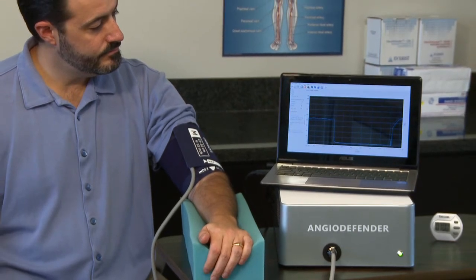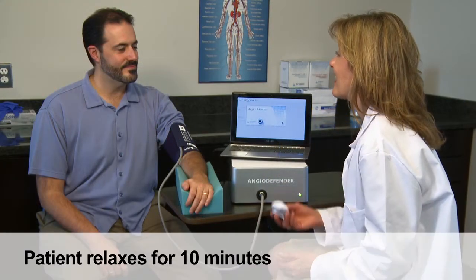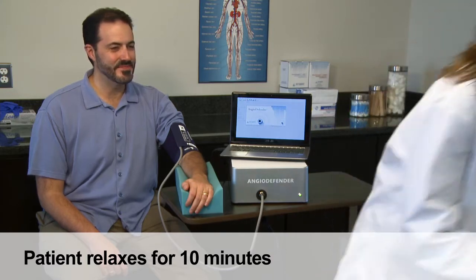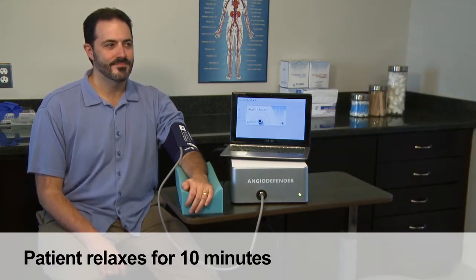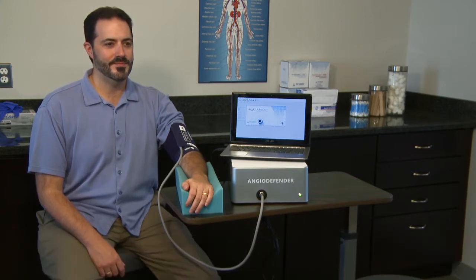The patient's arm should be relaxed and fully supported. The cuffed arm should be at the same level as the heart. The patient then rests for at least 10 minutes prior to the commencement of testing. The patient is instructed to remain relaxed and motionless for the duration of the test.